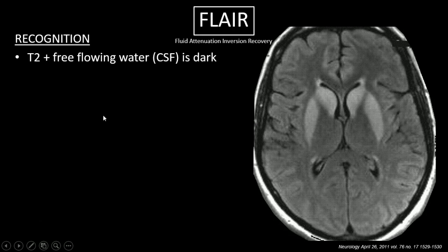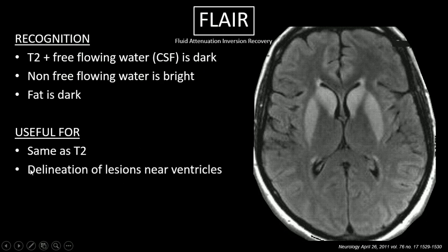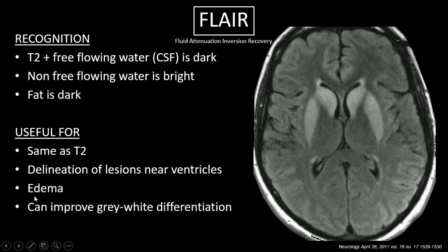I like to think of FLAIR as basically a T2 image, but the CSF spaces are flipped back to being dark or hypointense. It looks just like a T2 image — these deep basal ganglia structures, which don't have as much fat in them, look pretty bright. Fat is dark, but the CSF is also dark. Non-free-flowing water is bright. What is this useful for? Same as T2, but it does a better job of delineating lesions near the ventricles because edema would be bright in FLAIR, while the CSF is dark since it's free-flowing. It can also do a good job of gray-white differentiation — just look at the putamen and the head of the caudate; they really stand out.